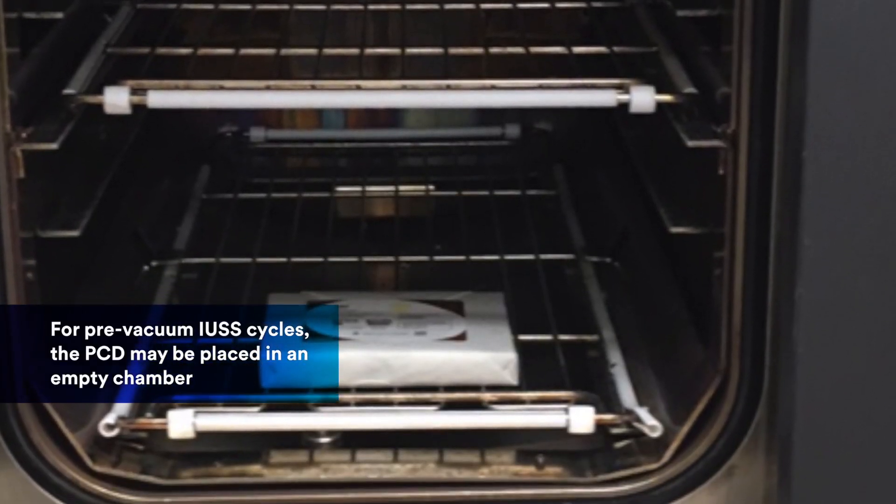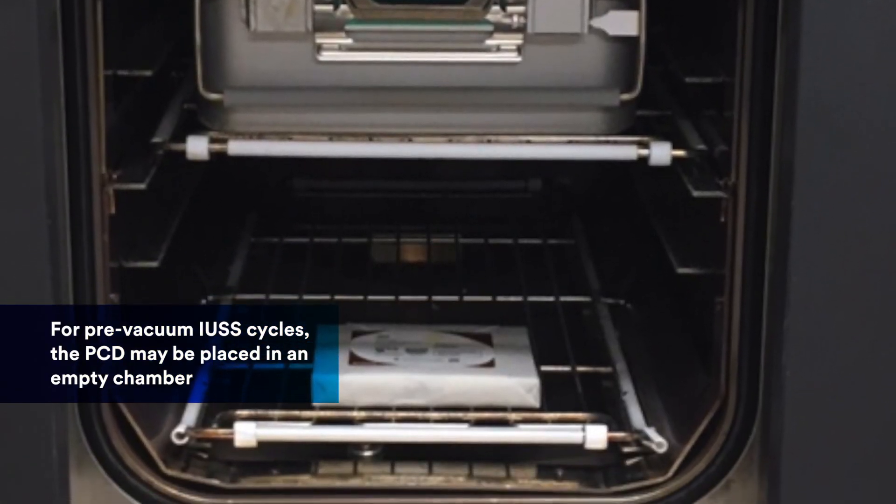When monitoring pre-vacuum IUSS sterilizers, the PCD may be placed in an empty chamber.